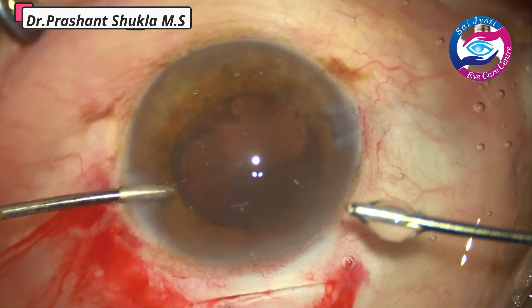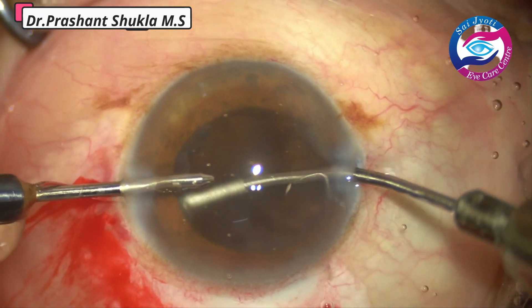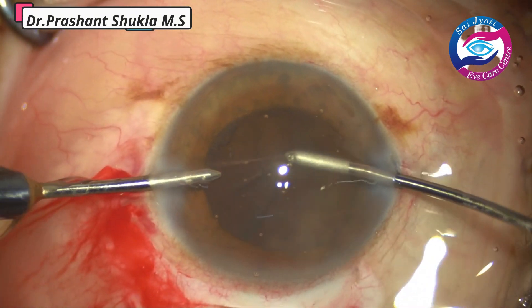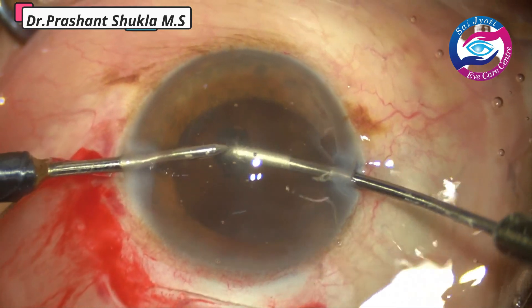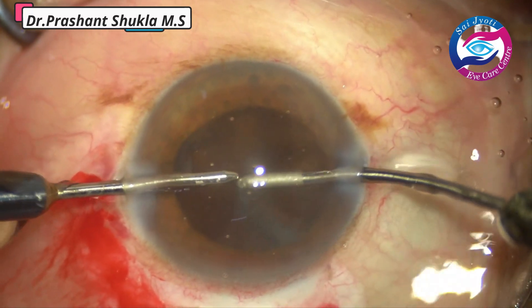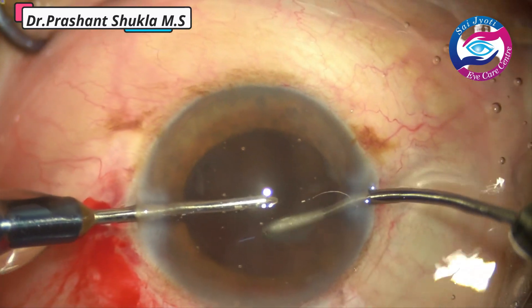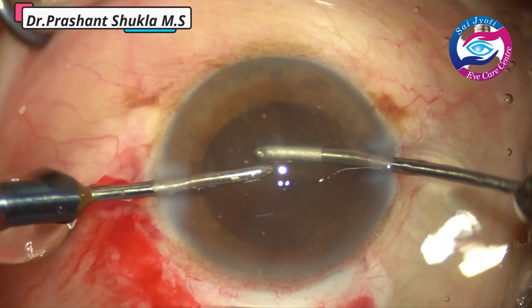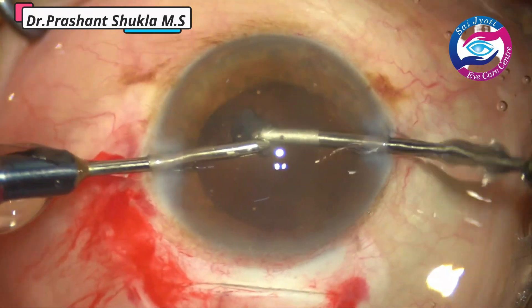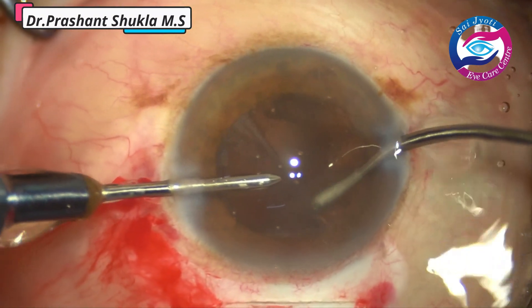Now I am using both irrigation and aspiration. If you have a very good scleral tunnel you can use bi-manual irrigation aspiration in small incision cataract surgeries. The bottle height is about 90 centimetres and vacuum is 300. The aspiration handpiece catches the cortex, pulls it into the centre, and then it is aspirated. With good foot control movements and cautious use of vacuum we can have a very stable anterior chamber when we use IA handpieces in SICS.